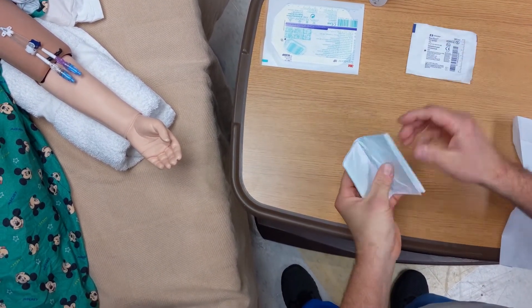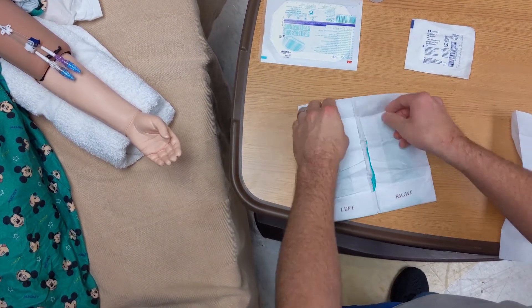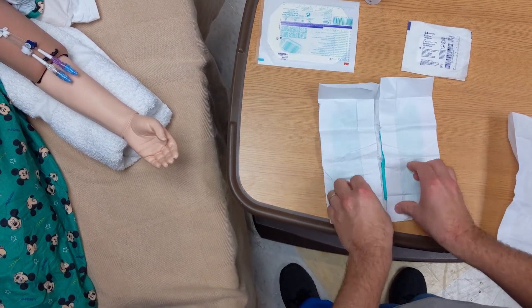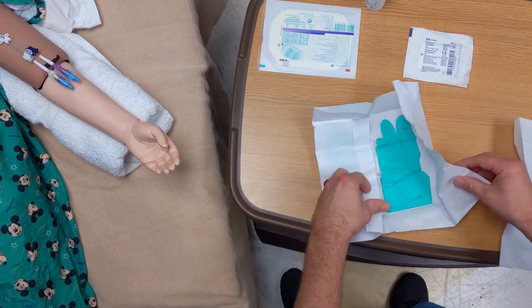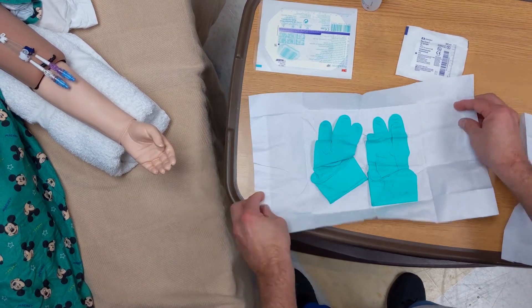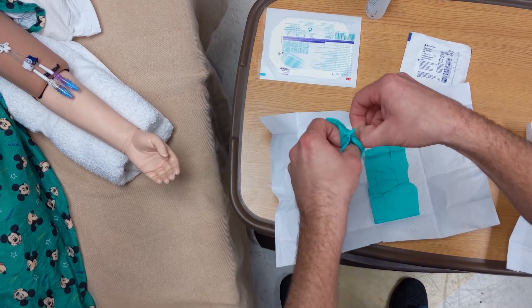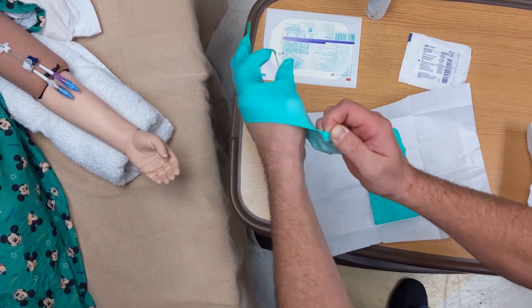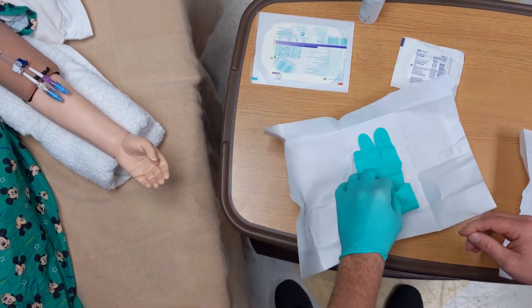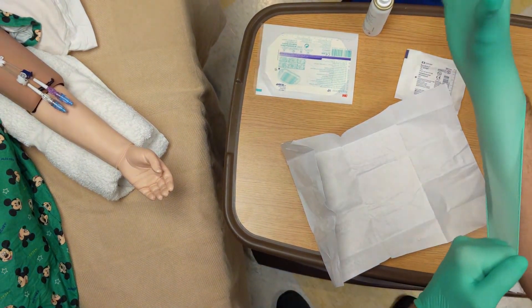Don a new set of sterile gloves in the same way you did it the first time, making sure that when you open the package you don't touch the inside. Put the gloves on, grabbing by the cuff that's folded over. It's okay if you can't get your fingers all the way in. Once you have both gloves on and both hands are sterile, you can use your hands to adjust the gloves.